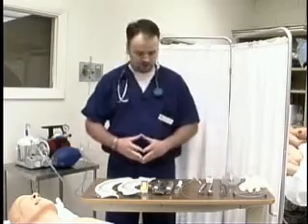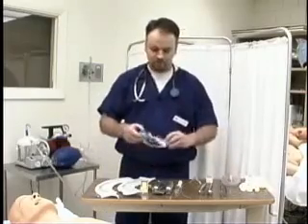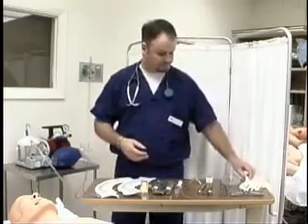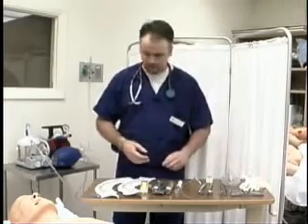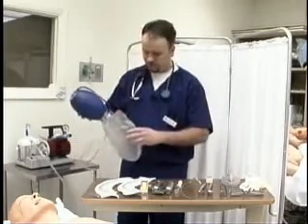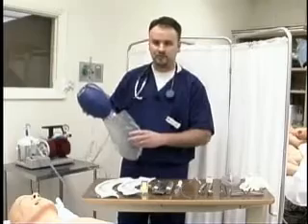Before we actually intubate the mannequin, we need to prepare for our intubation. We have some equipment here that we're going to need. First of all, you're going to need PPE — some protective eyewear like these goggles. We're going to need a set of disposable gloves. We're also going to need a working manual resuscitator bag with an oxygen reservoir so that we can deliver as close to 100% oxygen as possible.